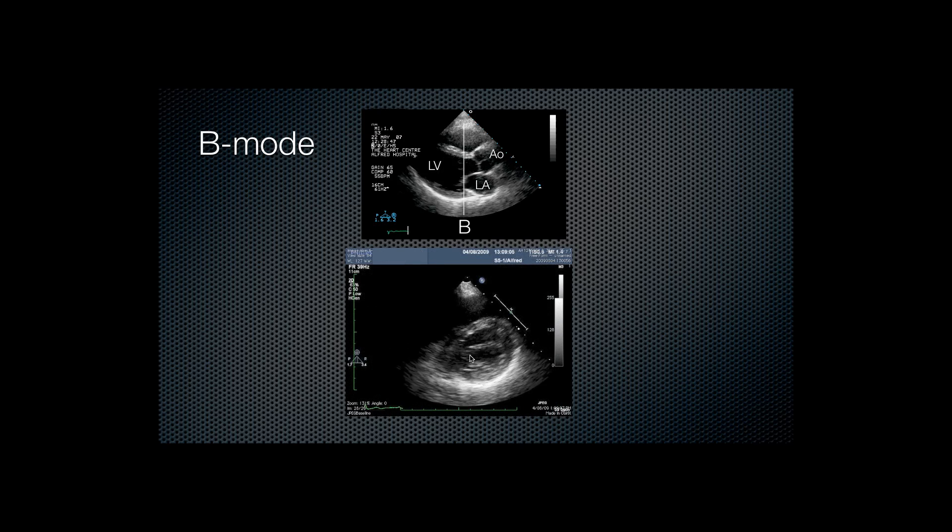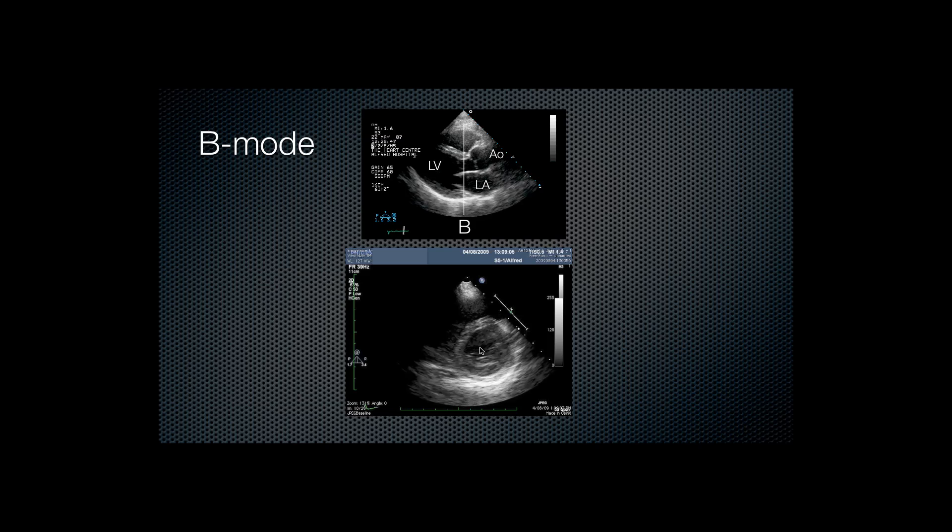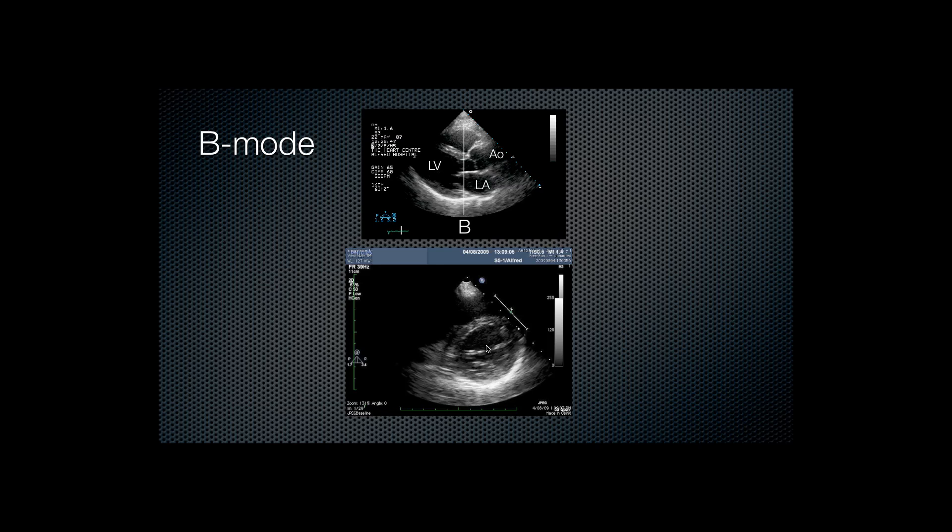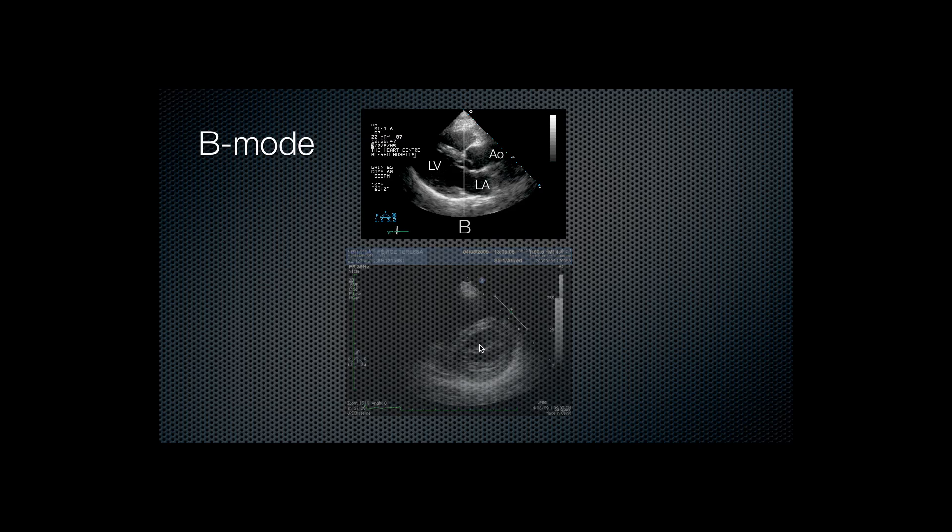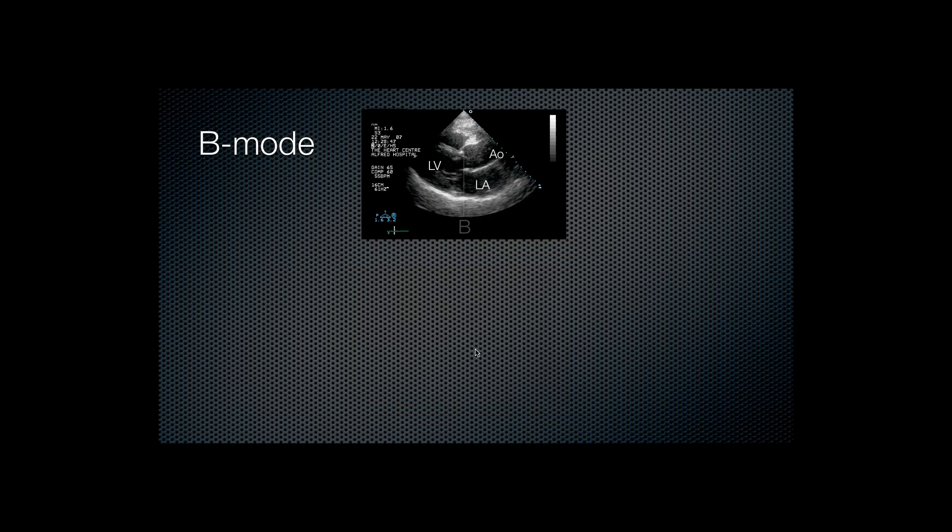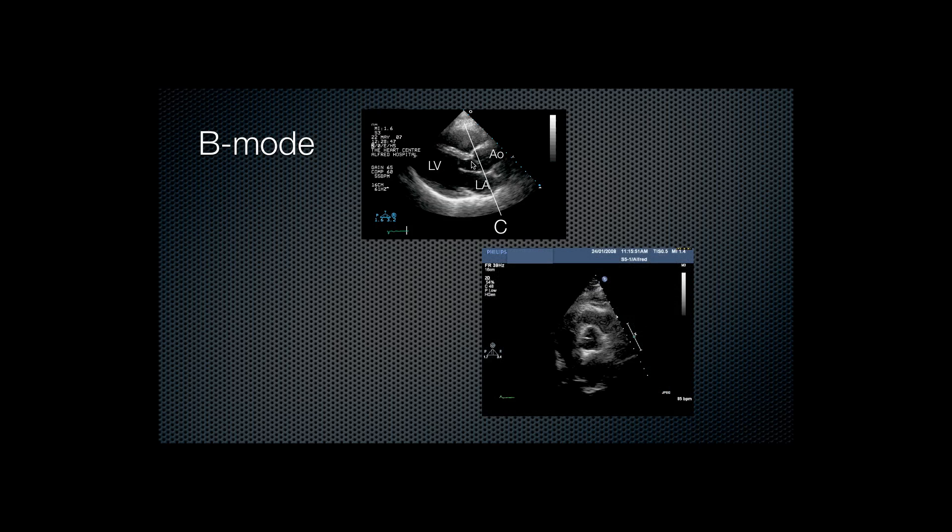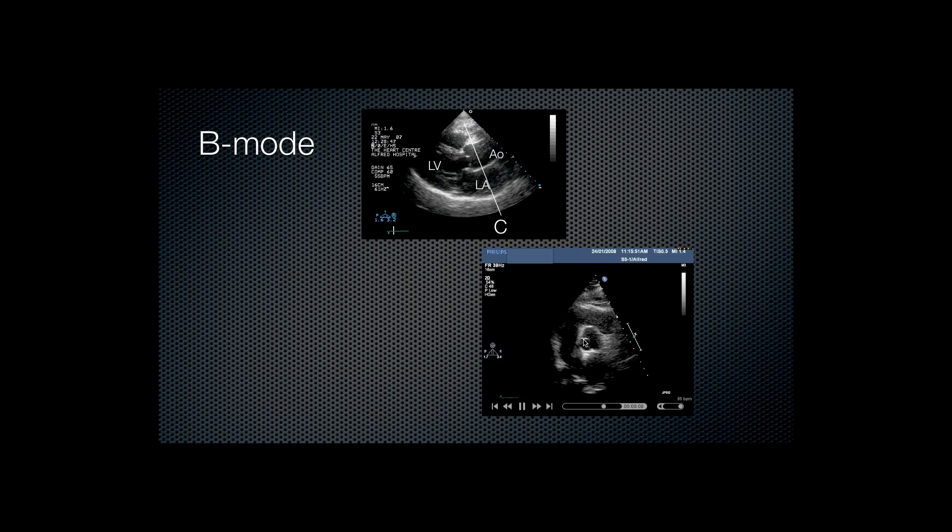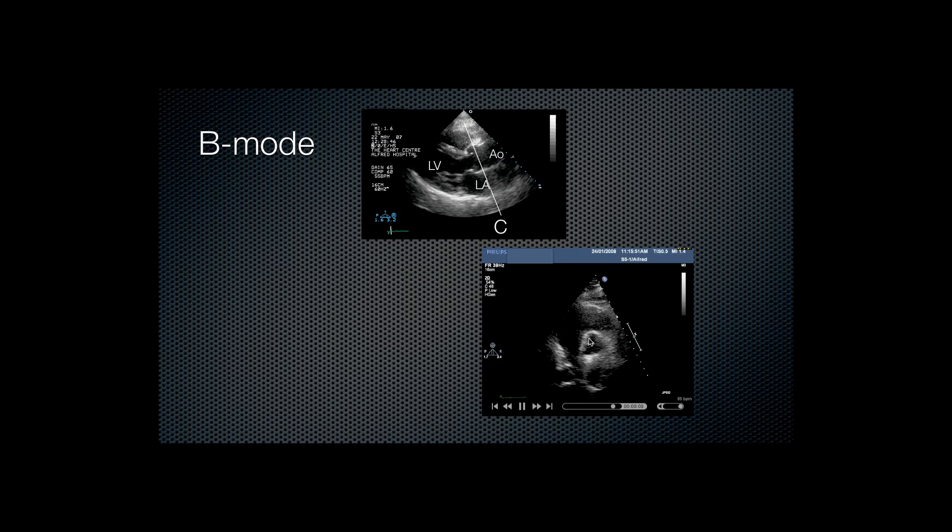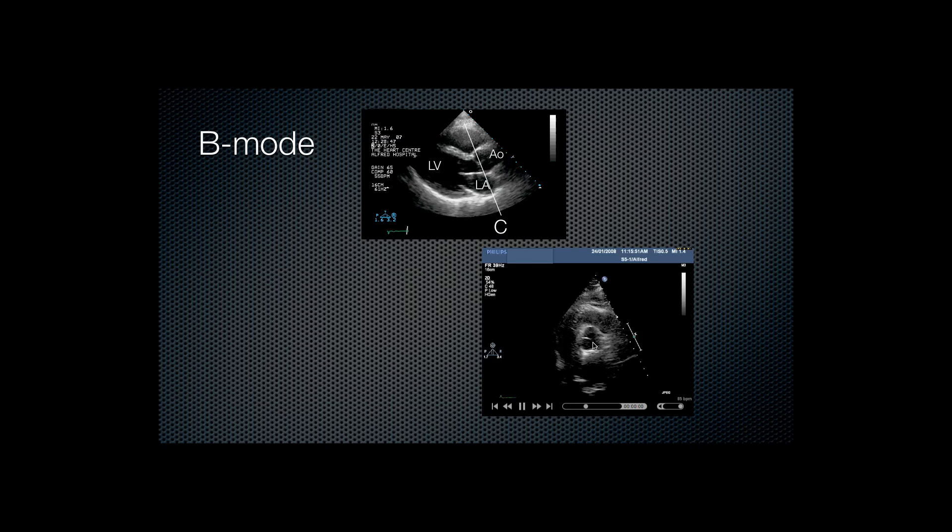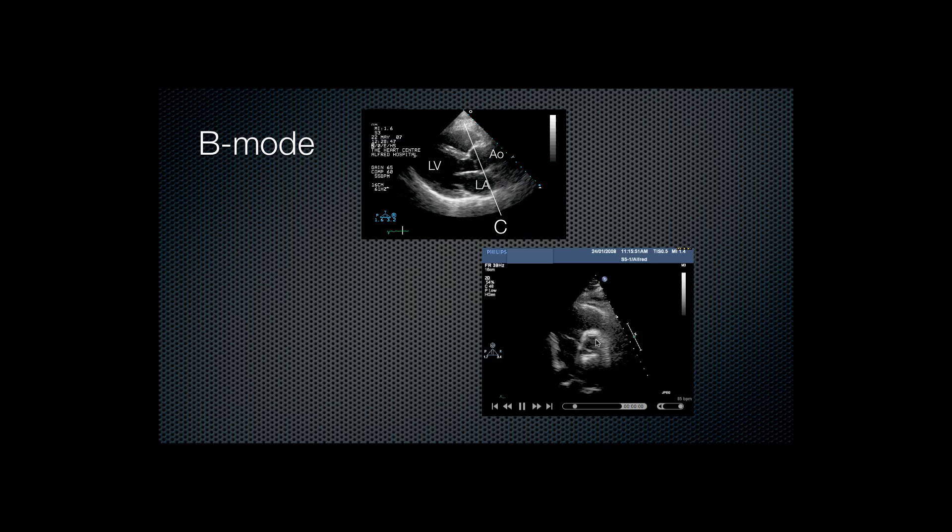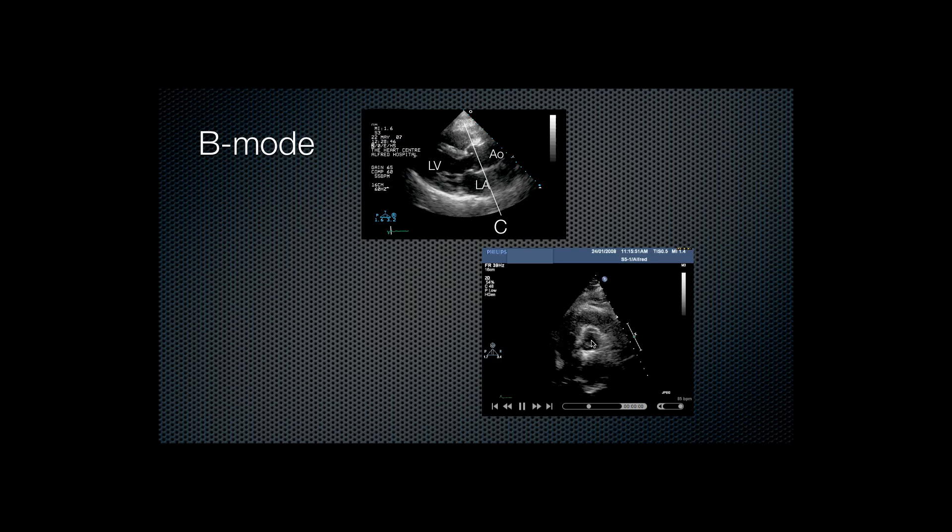Now a cut line here goes through the mitral valve. So at right angles, if we were to turn the probe, we would see this image with the mitral valve opening and closing. Lastly, we're at the level of the aortic valve. And the aortic valve is seen in cross section along that line of sight of C with three leaflets opening and closing.